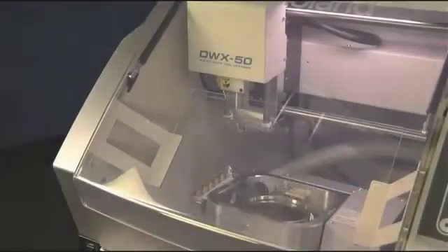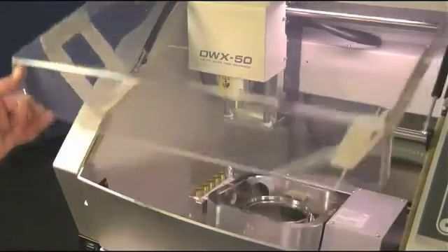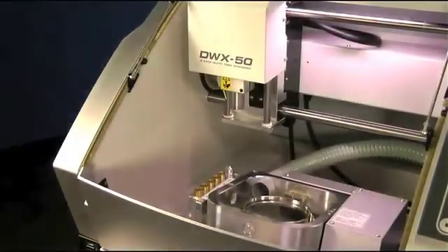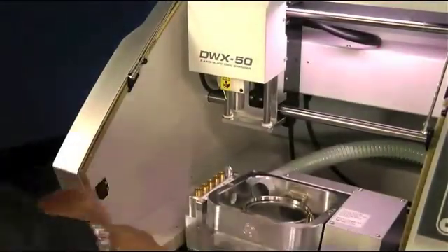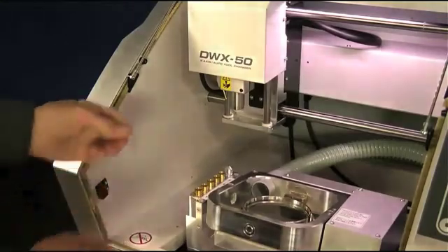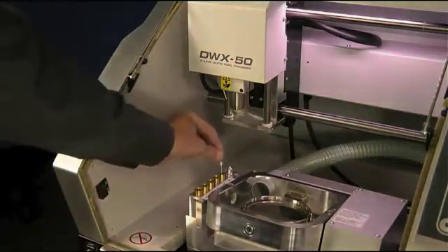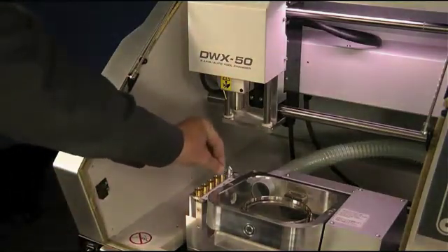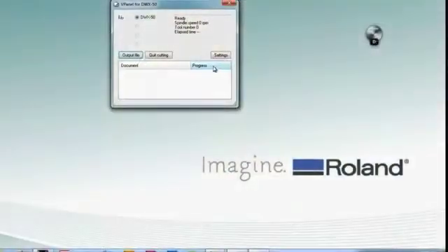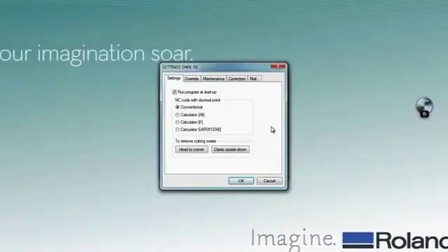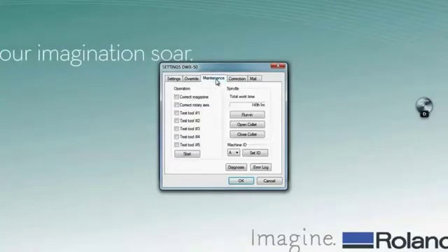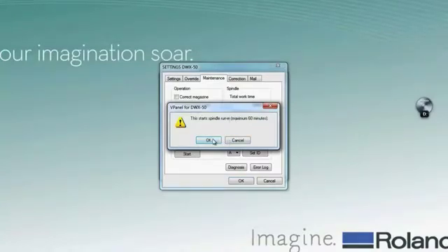And finally you will place the calibration pin included with your accessories in tool slot number 5, where you will then run the calibration program from your DWX software. Before the calibration, you will run the spindle run-in by clicking on the settings tab in virtual panel. Then you will go to your maintenance tab. You will see the run-in button. You click on that and click OK. It could take up to 60 minutes for this process to finish.